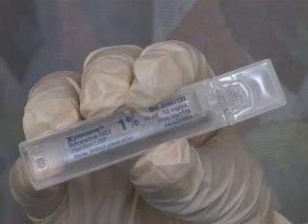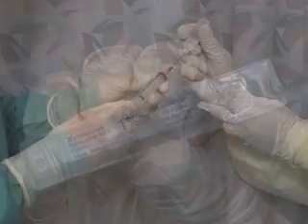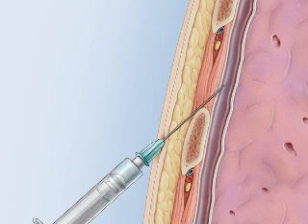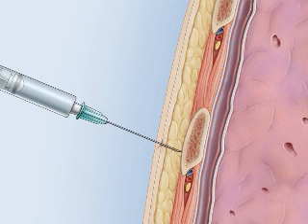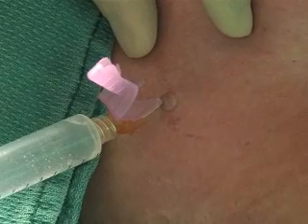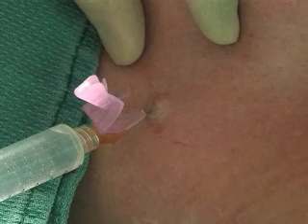Adequate analgesia is a very important step in this procedure, as chest tube insertions can often be very painful for the patient. The skin, subcutaneous tissues, deeper tissue layers, parietal pleura, and periosteal surface of the rib below the intended insertion site must be generously anesthetized. Using the smallest gauge needle, create a wheel of anesthetic in the skin overlying the landmark spot.